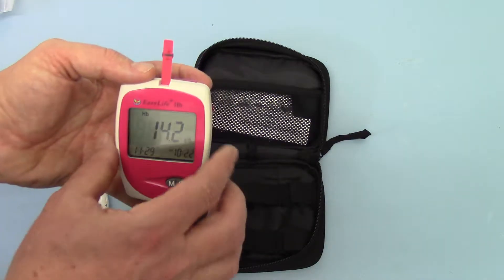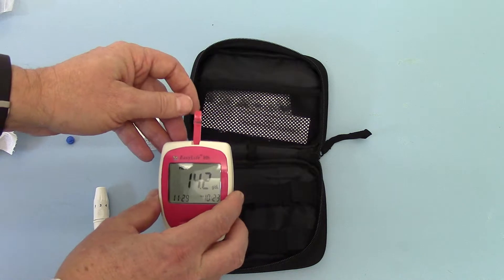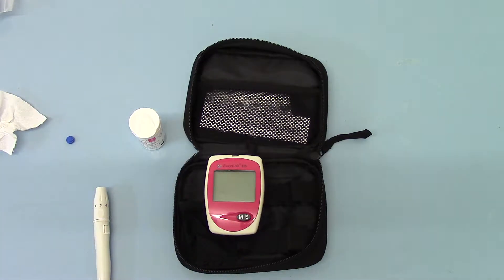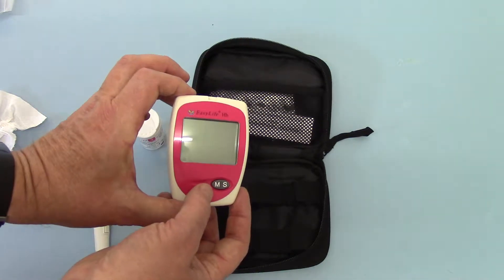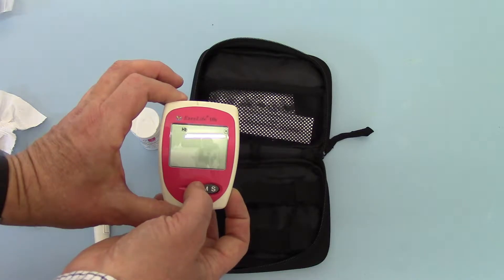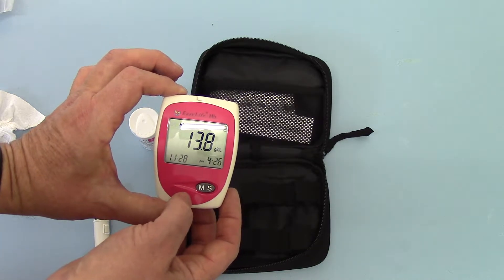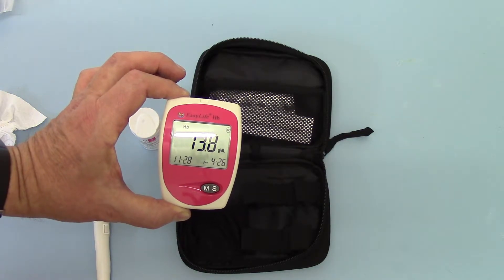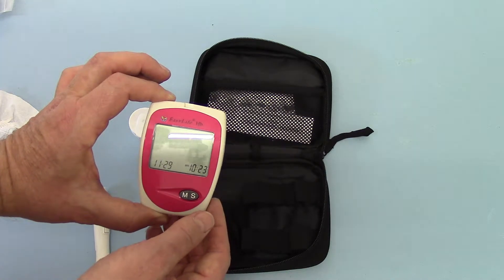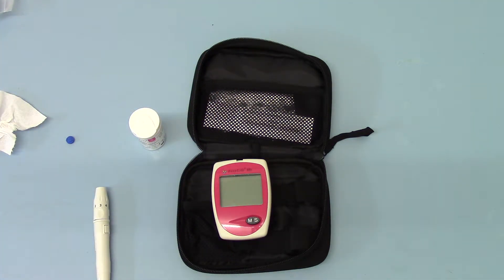That reading is now in the memory. It will continue to display. If you take the test strip out and dispose of it, you can come back to the meter to see your previous readings — press the M button and it shows memory one and then the reading. Press it again and it goes to memory two and the reading. You can scroll through the memories using the memory function. If you press S at any time, it will just clear it back to zero. Leave it and it will switch itself off after a couple of seconds.